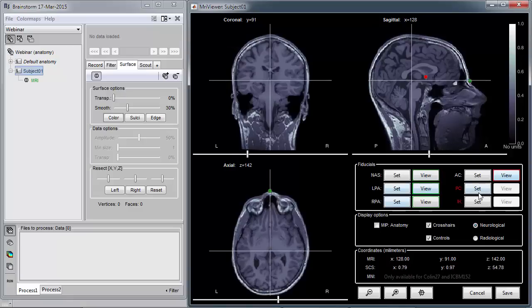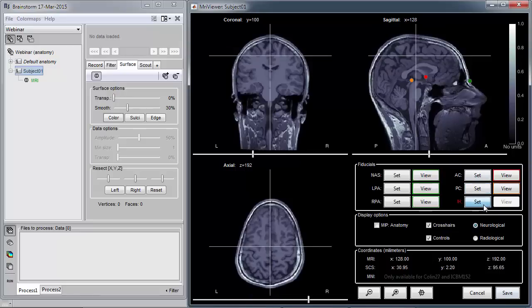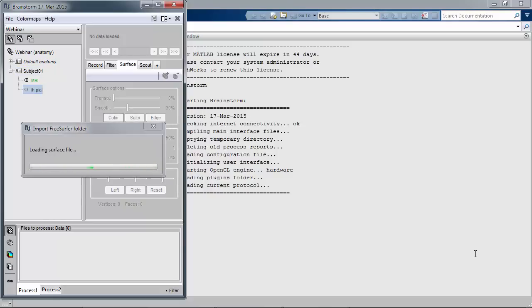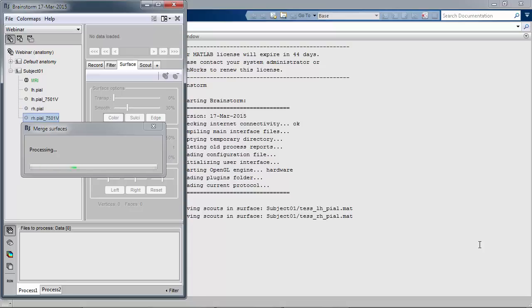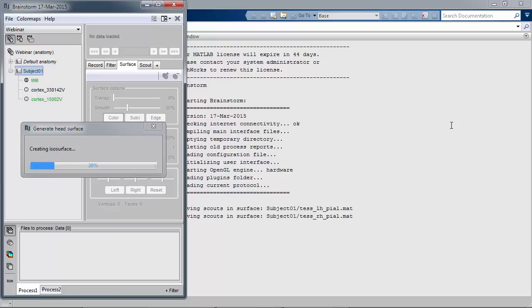We're going to mark also typical anatomical landmarks used eventually to co-register subjects with one another to conduct group studies. Once this is done, Brainstorm will import the whole packet of MRI files and processed MRI files — the volume but also the surfaces that you will see in a moment. We also have the capacity to import atlases and regions of interest identified by MRI processing software, including subcortical atlases with structures like the thalamus and putamen.